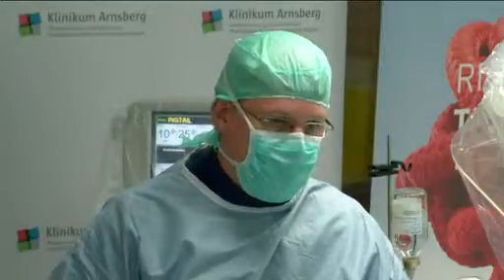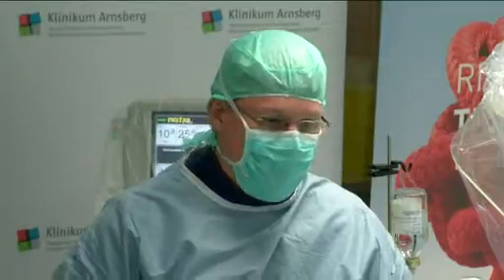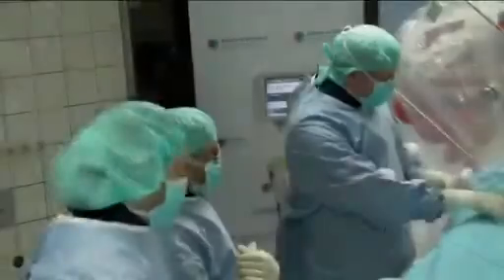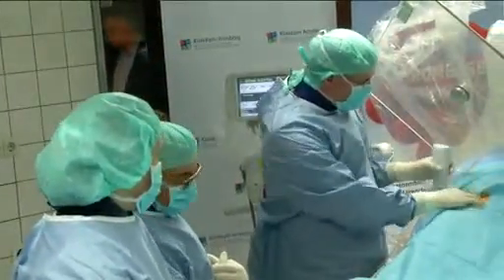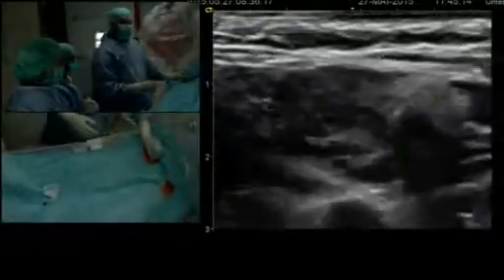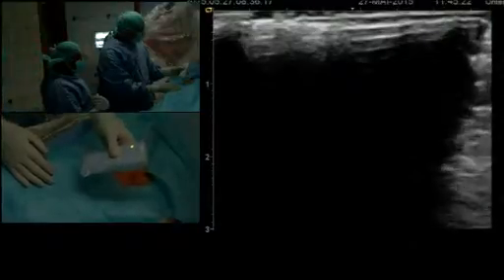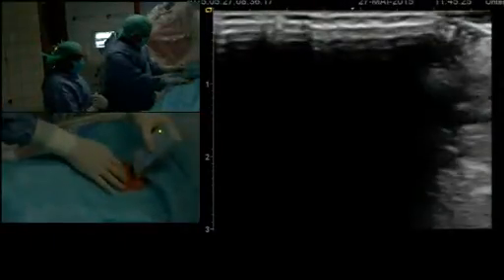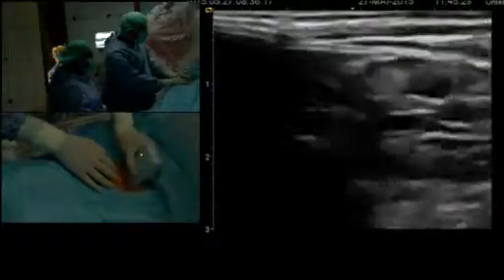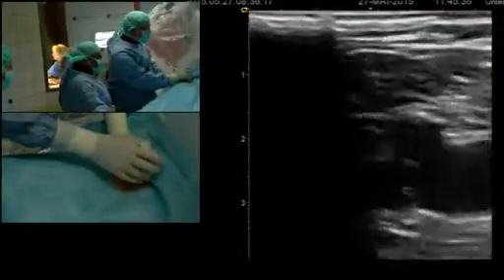For this purpose, we will go in from the contralateral side, perform a crossover maneuver, and then go ahead into the artificial bypass. For the first step, I just want to briefly introduce you to a new ultrasound machine from Siemens, which is cable-free, as you can see here. It is connected to a monitor using Bluetooth technology, and with that we can easily access and puncture a femoral system here.